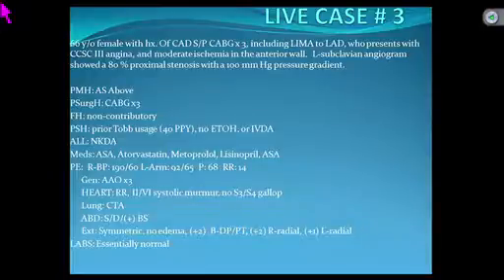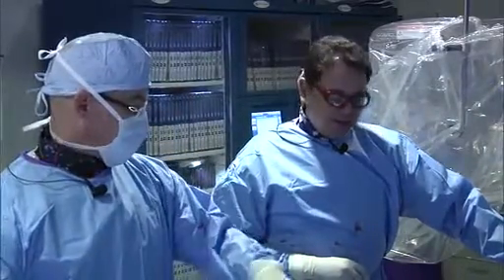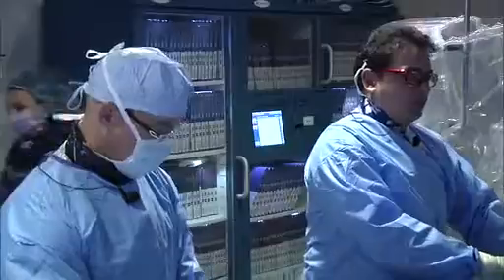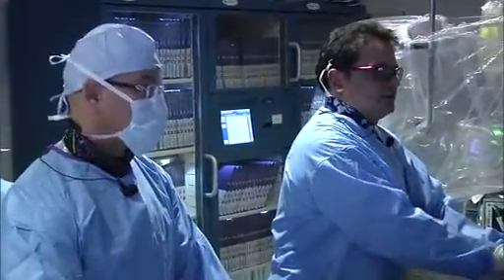Great, thank you so much, Dr. Fernane. As Dr. Fernane presented, Dr. Dangas, a very typical case, and I want to tell you part of the workup that we did. We discussed this case with Dr. Fernane earlier in preparation for what we were going to do live for you. Part of the workup was a CAT scan angiogram, which we did to see the integrity of the vertebrobasilar system.